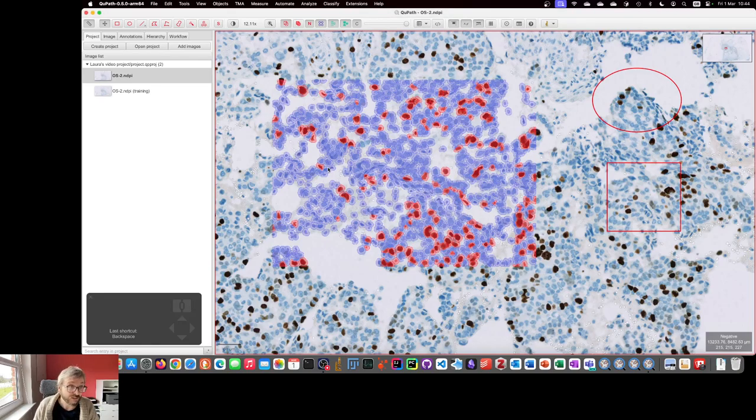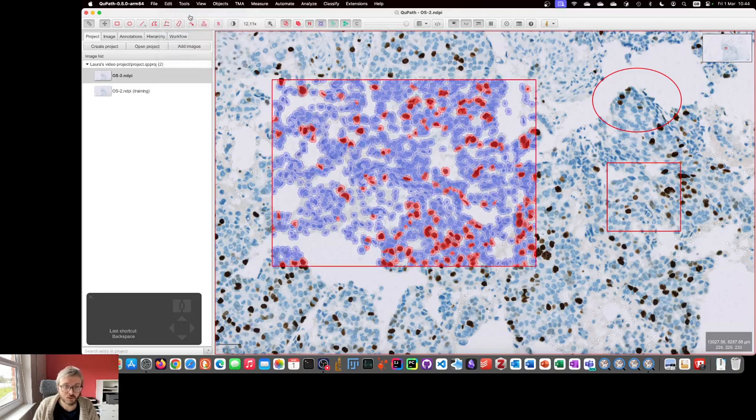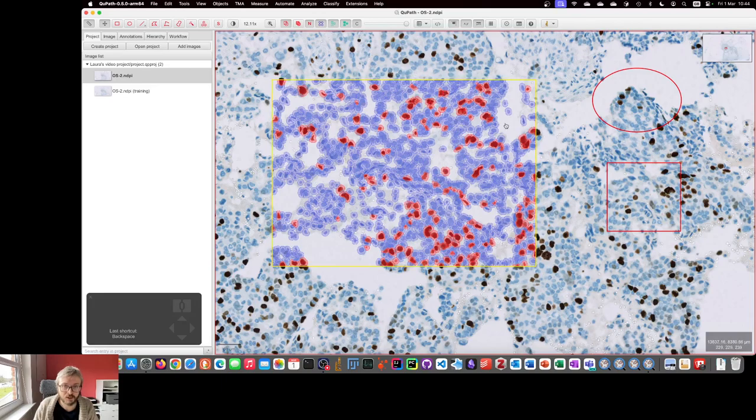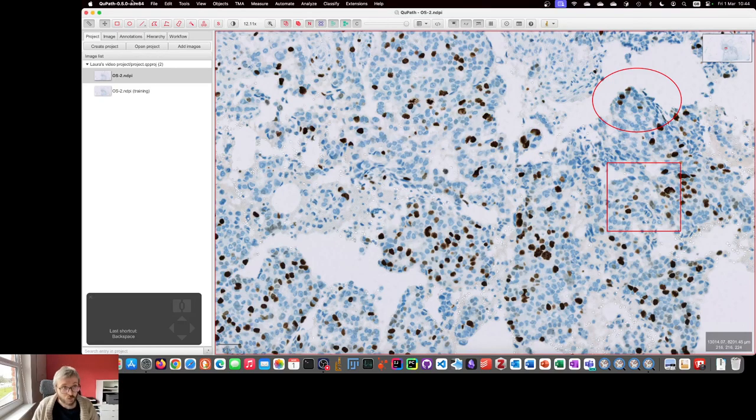So, the easiest way to resolve this is to go with Edit, Undo. I've Undo a couple of times, it's restored those. Undo again, and this says Restored. The outer annotation, Backspace, don't keep them, then they're gone.